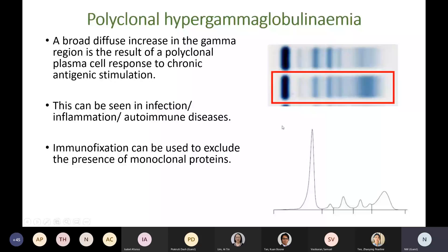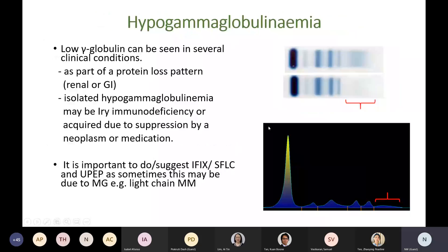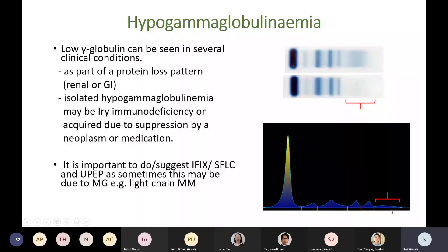Consider this serum protein electrophoresis: on agarose gel compared to normal, there are no visible gamma globulins. Similarly, on capillary electrophoresis, the gamma region is very low. Low gamma globulins can be seen in several clinical conditions — it could be part of renal or GI protein loss. Isolated hypogammaglobulinemia may be due to primary immunodeficiency or be acquired due to suppression by neoplastic disease or medication. It is important to perform or suggest immunofixation, free light chain analysis, and urine protein electrophoresis, as sometimes this may be due to monoclonal gammopathy such as light chain multiple myeloma.